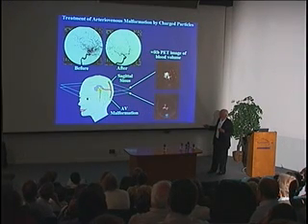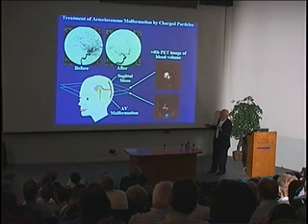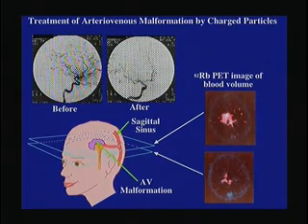Another disease that's a very tough disease to treat because of neurosurgical complications is arterial venous malformation. And that is when it's a congenital malformation where arterioles and venous form a basket of activity such as this. And what needs to be done is to ablate this area, that is to cut it out, tie it off. And one way to do that is to put in radiation so that it will sclerose and go from this to this without having to enter the skull. So this has been a very effective therapy practiced at Berkeley and now being practiced at Loma Linda.